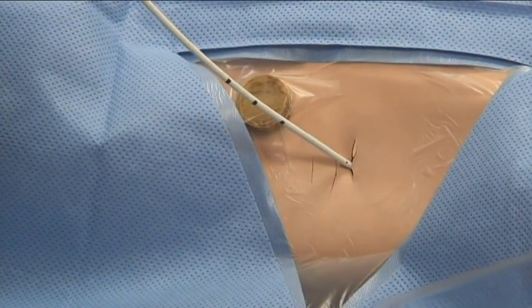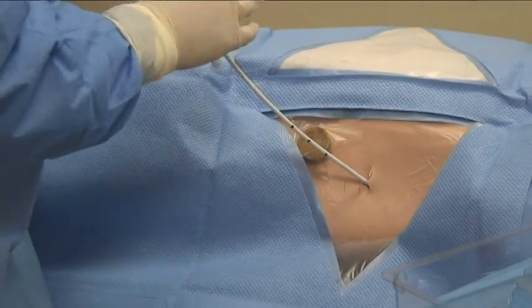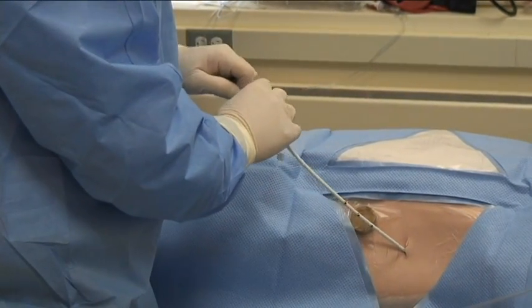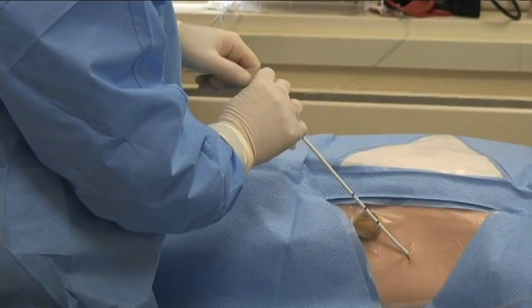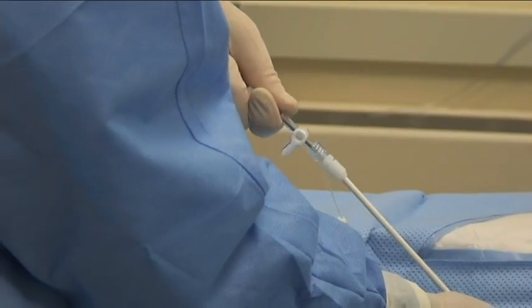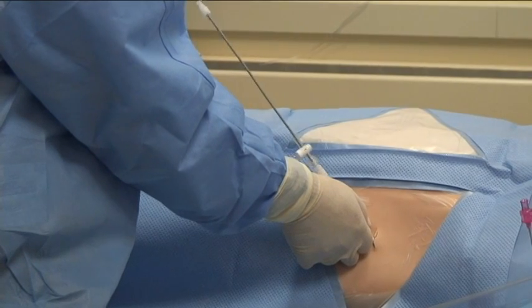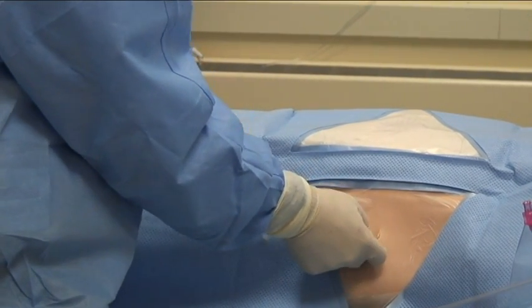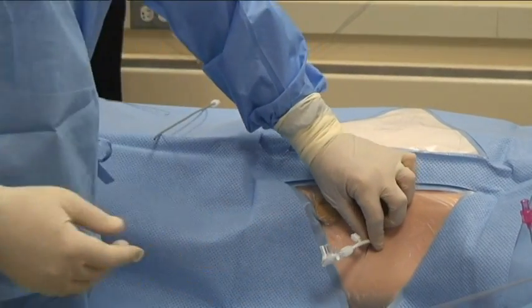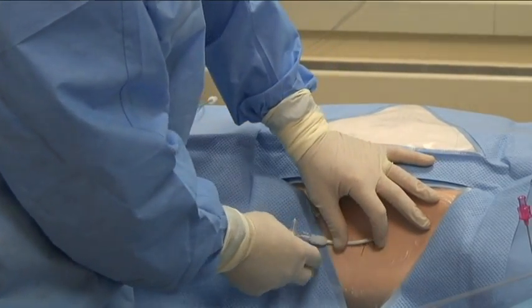Now, I've gotten a little ways, and at this point, I can remove the guide wire as well as this trocar. This trocar is stiff, so you don't want to put that all the way into the lung, as it can cause damage. So at this point, you can unscrew this trocar and actually begin to loosen it up, and then this catheter can be fed in over the wire and the trocar. You can remove the wire, and then you can remove the trocar and the catheter's in place. It does not need to go all the way in. This is usually an adequate amount, leaving a few inches out.